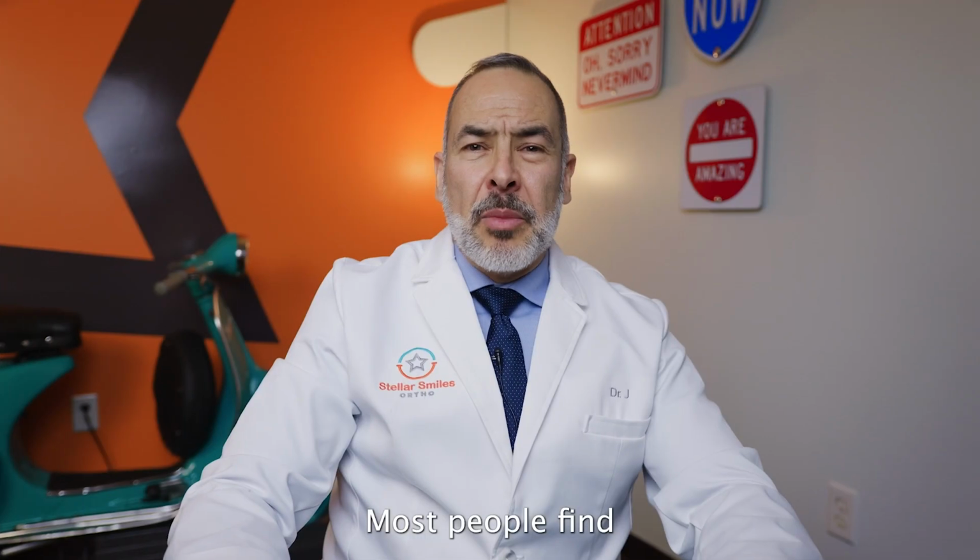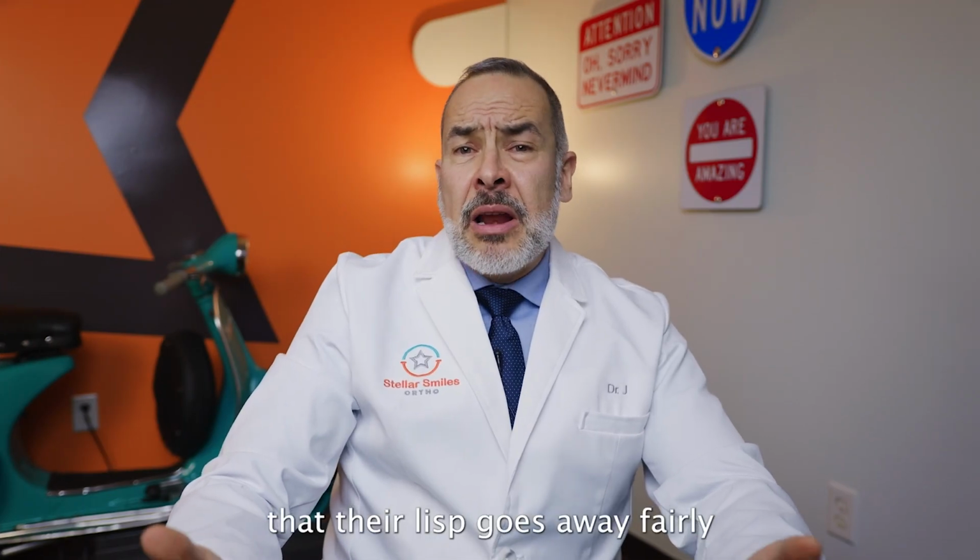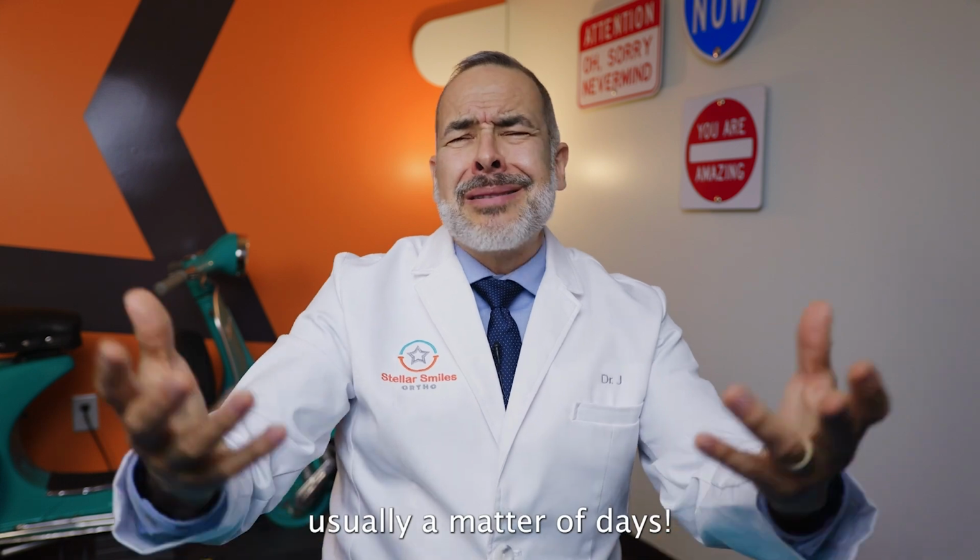When you get your aligners, the mouth isn't used to the new material's thickness, so that causes a lisp. But don't worry, the tongue is a muscle and it's able to adapt. I always encourage my patients to talk a lot. And if you're not the talkative type, then watch your favorite TV show and repeat aloud everything they say, or sing your favorite song. Most people find that their lisp goes away fairly soon after starting treatment, usually a matter of days.